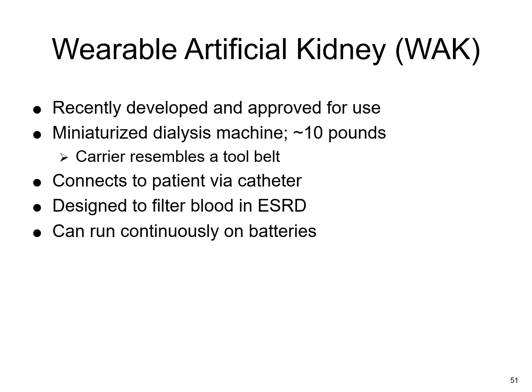Just know that this is out there. This is a new thing that they started. So it's recently developed and approved for use. It's a wearable artificial kidney. I do not know anyone who's using this. Please let me know if you do.